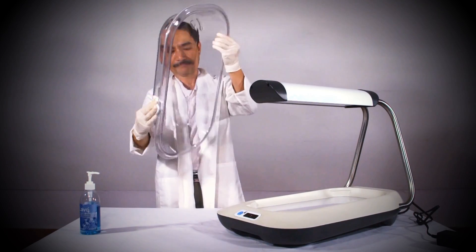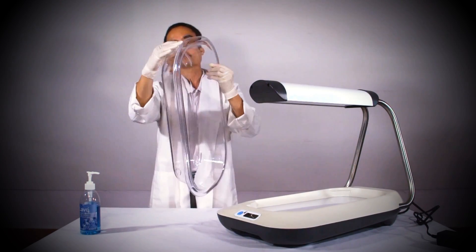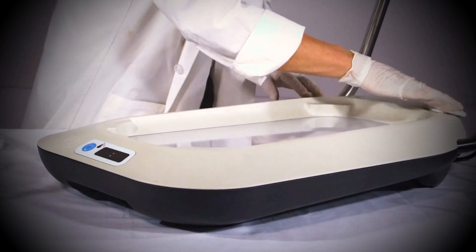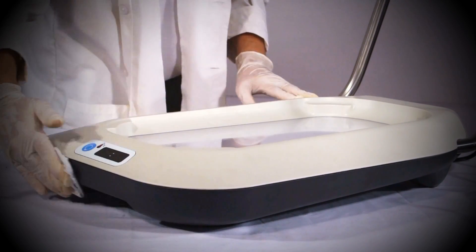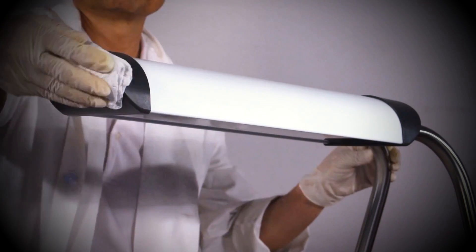This must be done before and after use by each baby. To do this, first use a wet cloth to wipe down the unit and then use a disinfecting solution.